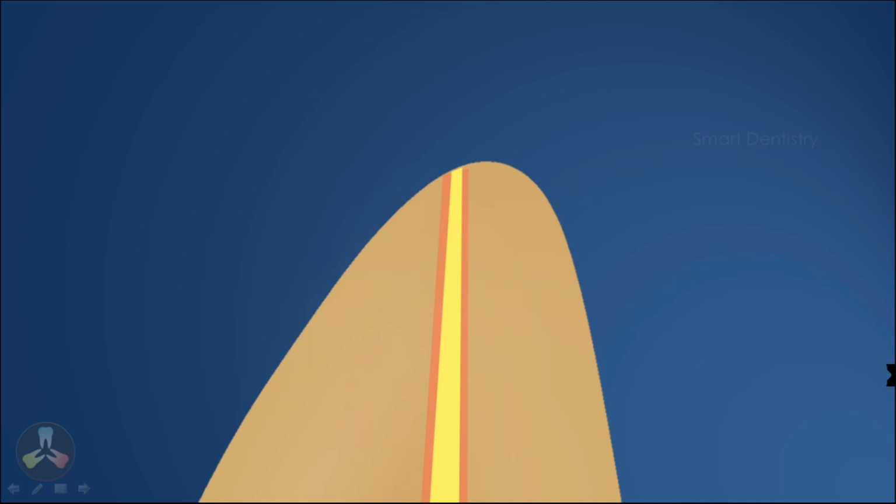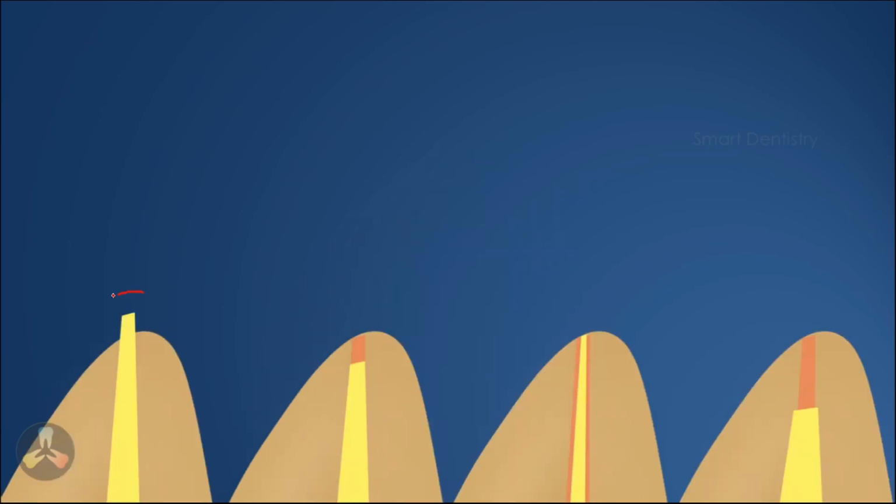Then what about the situation number 1? Don't you think it will fail? Yes, it can give some problem, but keep it in mind, Gutta-percha is a very biocompatible material. The root canal treatment will fail not because it is beyond apex. The root canal treatment will always fail if we are not able to provide a good fit or a tug back at the root apex.